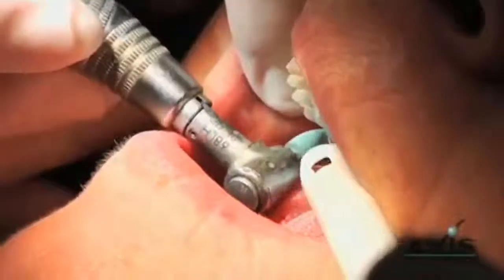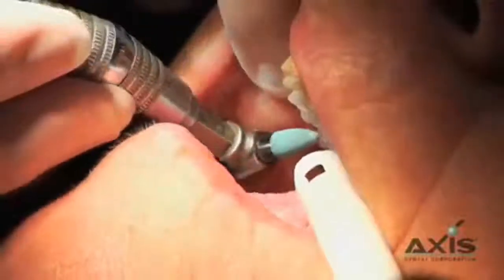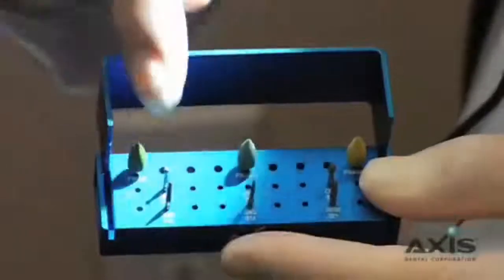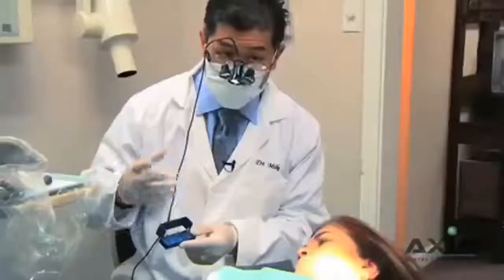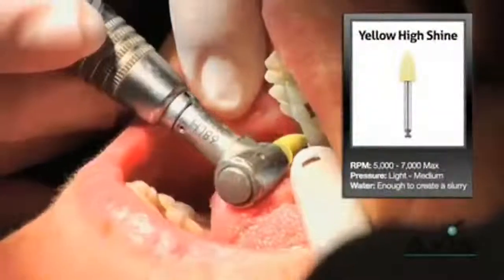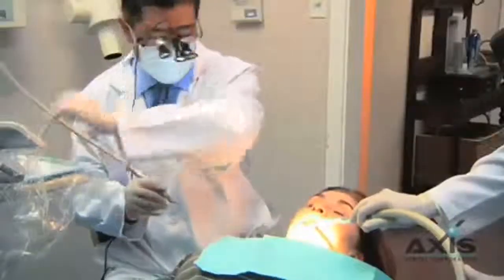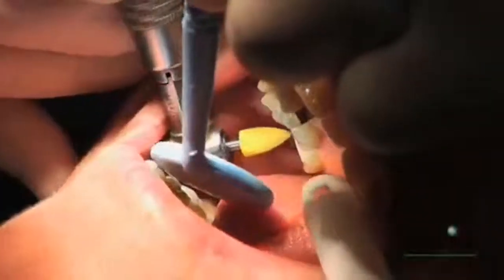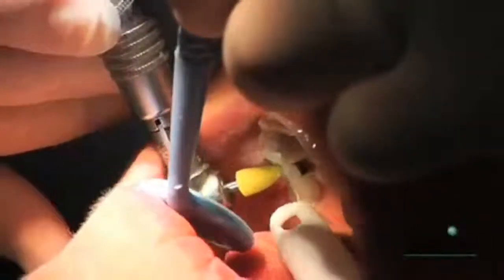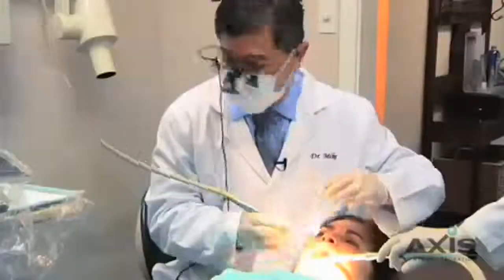The air is keeping the porcelain cool. I'm moving the polisher around different areas of the porcelain so I don't overheat it in one area. The three-step system is meant to be very easy to use and very quick — just green, blue, and yellow. Make sure you use each one until it has done what it can do for you. Many times I don't even go back in with polishing paste; I'll just stop with the yellow because it gives a nice shine. Looking really good. Some other porcelain polishing kits out there cause the patient to feel a lot of vibration and chatter, but this is fairly soft.